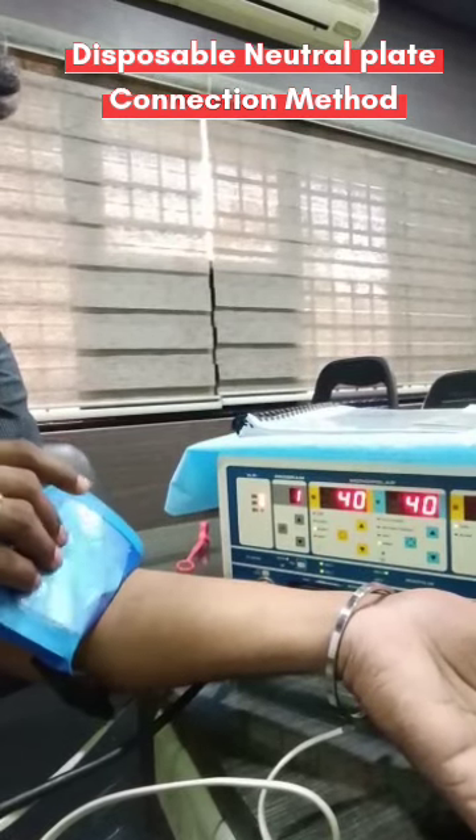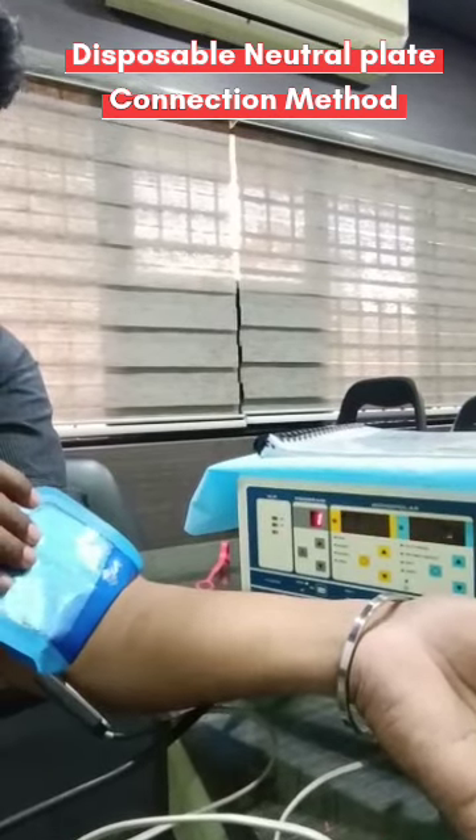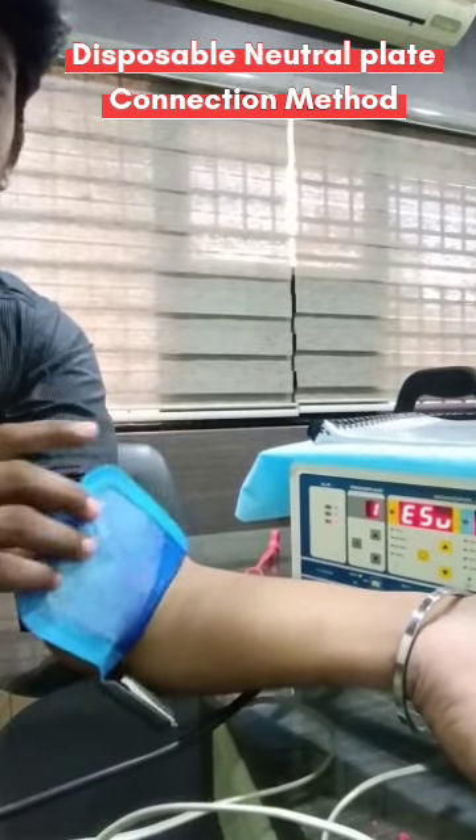If removal exceeds 50%, the machine will automatically reduce the power. If you remove more than that, it's a safety concern, so it automatically gives a third level of indication with the error 'No NP' and the machine goes into standby mode.